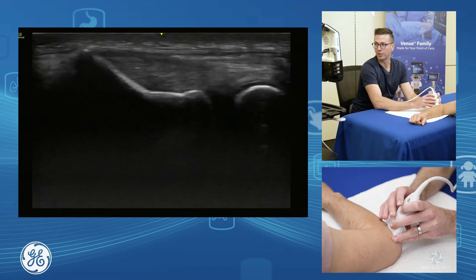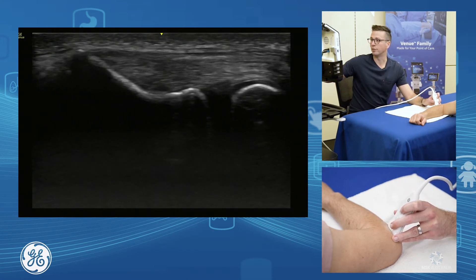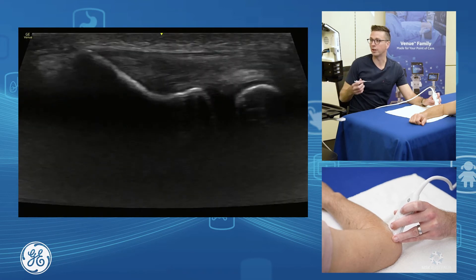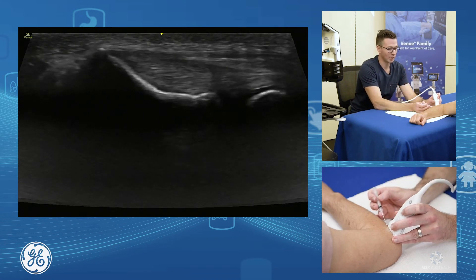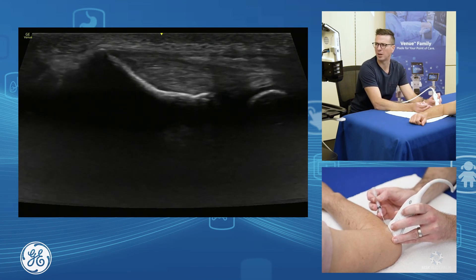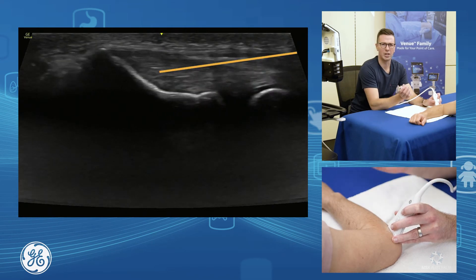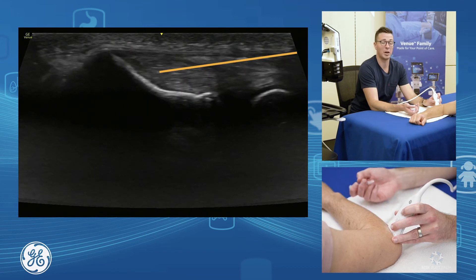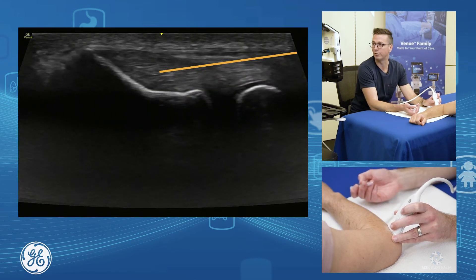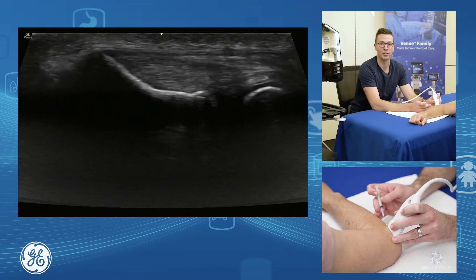Injection therapy for our common extensor — probably the nicest way to do it is in longitudinal. I'll often use a virtual convex appearance through here and bring myself across. I'll bring my needle in from a lateral approach, starting back about a centimetre and quite flat, and you bring your needle in down and underneath. You can do dry needling, intratendinous injections, or a peritendinous injection — whatever you're trying to treat. This is the nice way of injecting our common extensor.